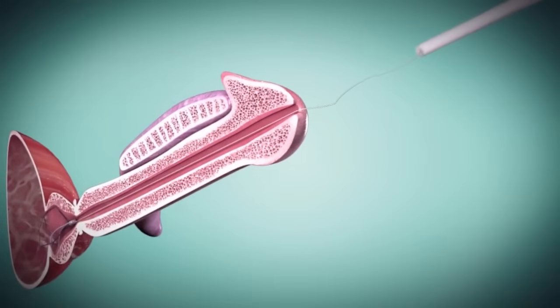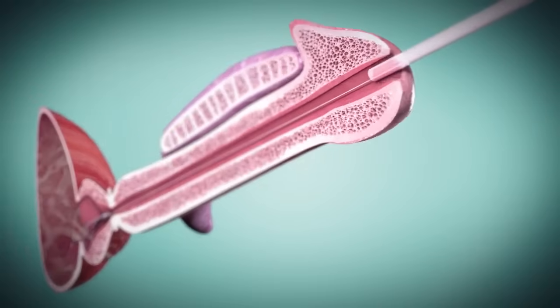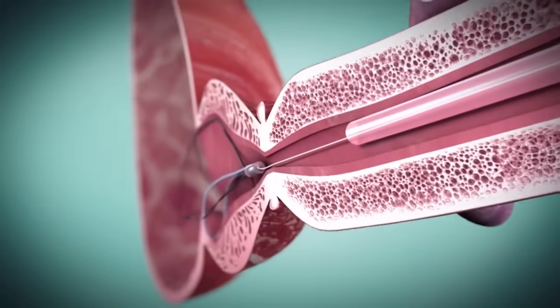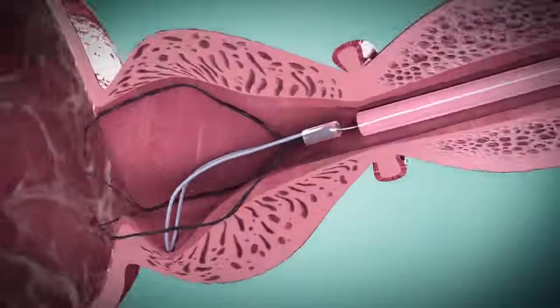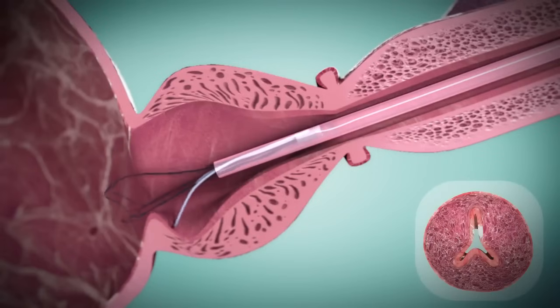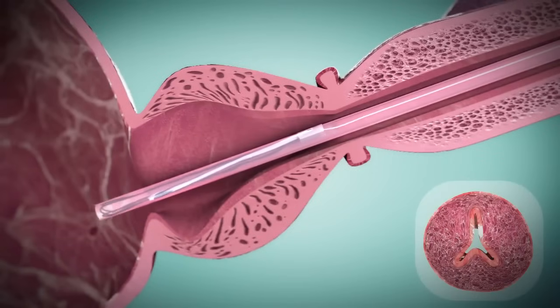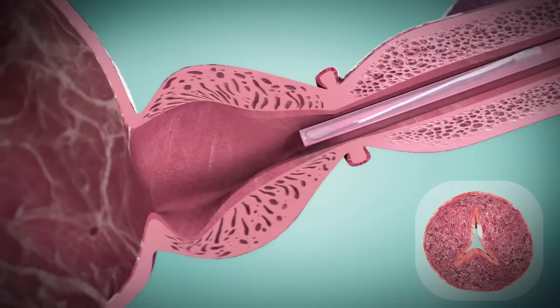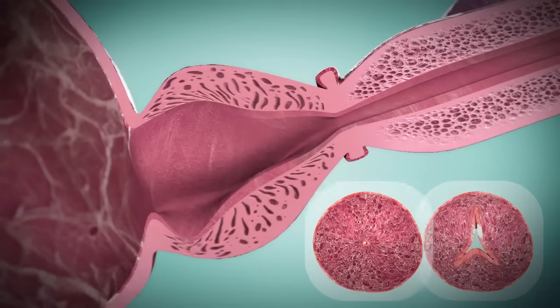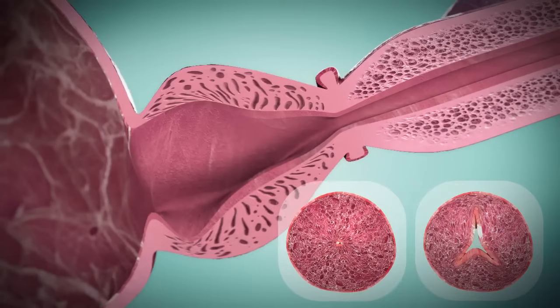First, the retrieval suture is threaded through an open-ended silicone Foley catheter. The catheter is advanced until it meets the ITIND. Once reaching the device, the retrieval suture is pulled taut and the ITIND device is easily collapsed into the catheter and removed through the urethra. Once the device is removed, deep incisions and an open pathway through the prostatic urethra can be observed. The procedure is now finished.